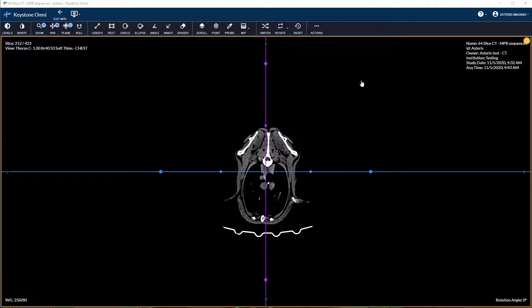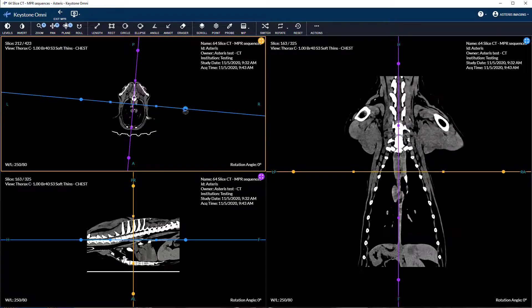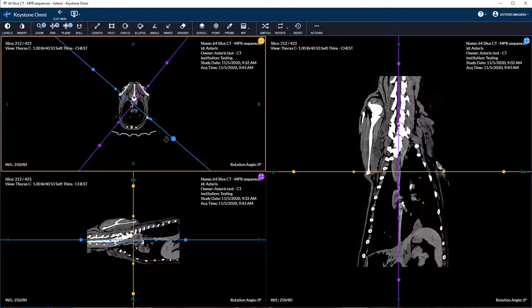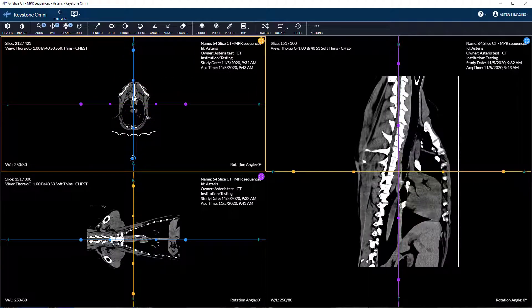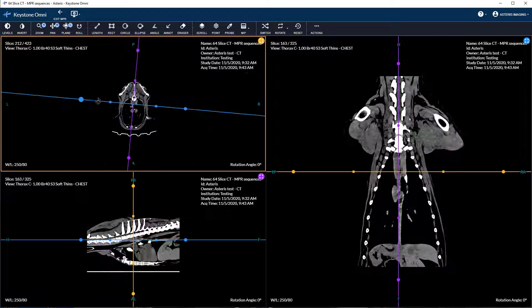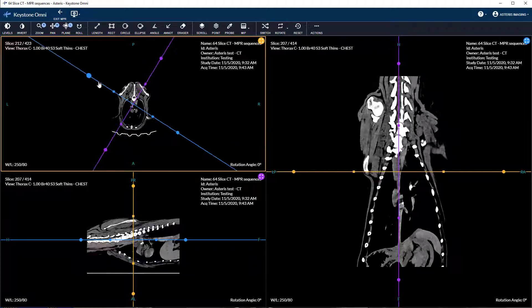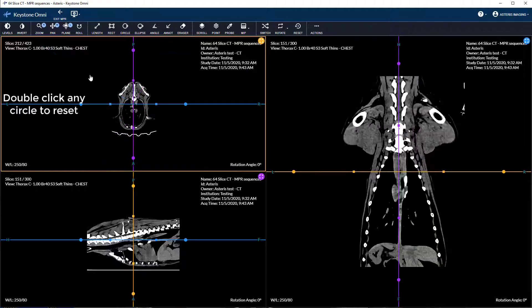To rotate any given axis, click and drag any of the available circular handles. Both respective planes will rotate simultaneously. Double clicking any of the circles resets the axes to their default position.